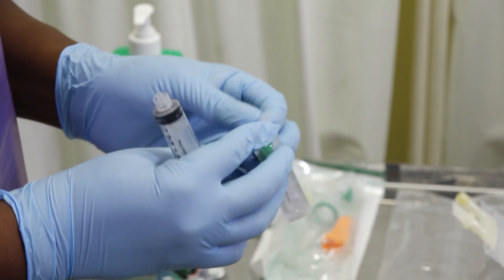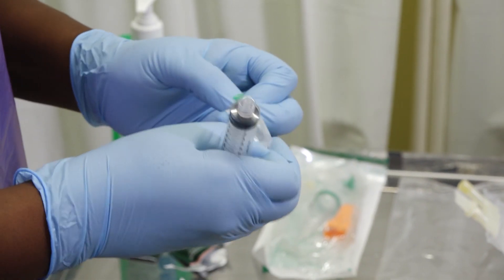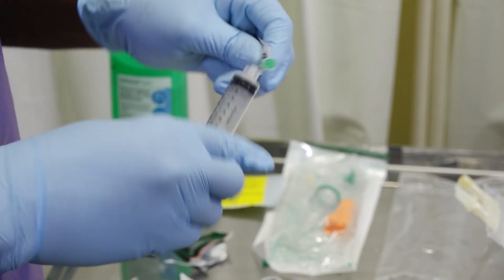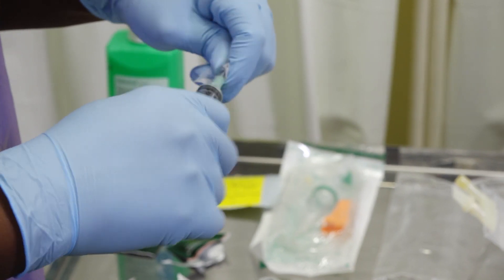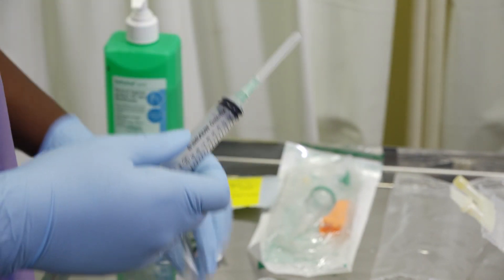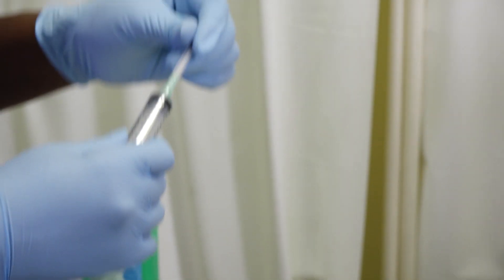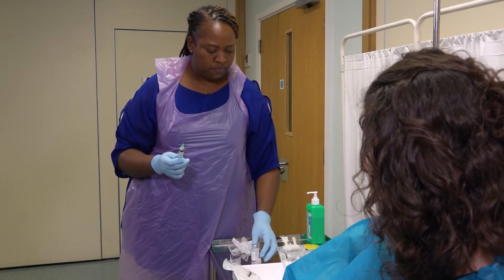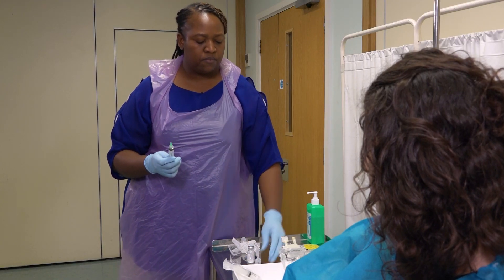Refer to the drug information leaflet for specific reconstitution instructions, such as the type and volume of dilutant. In this case we will use 10ml of sterile water for injection.